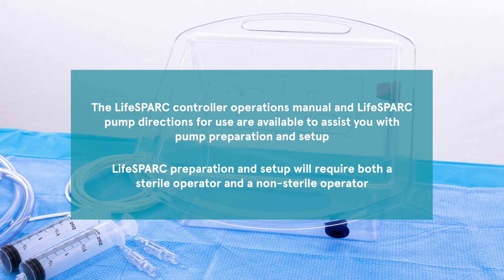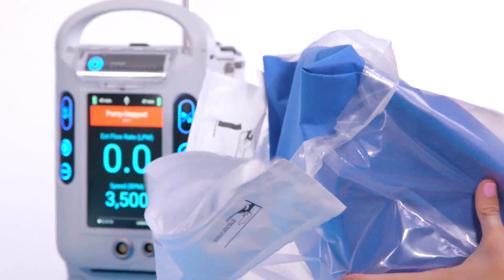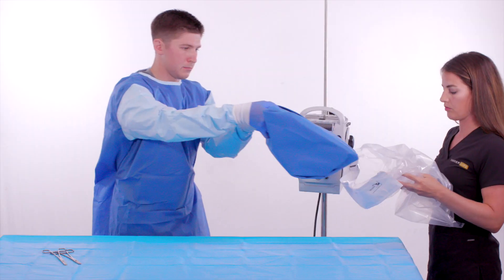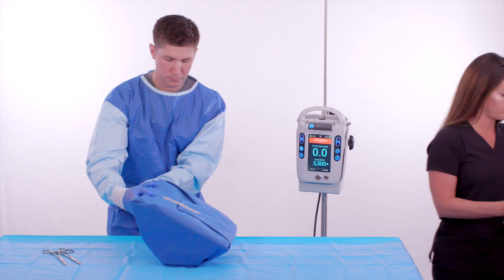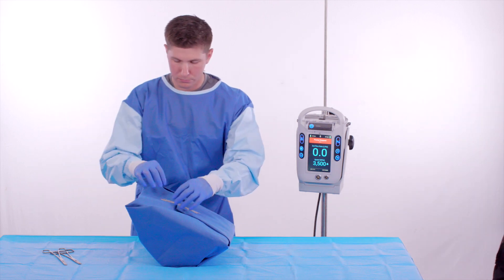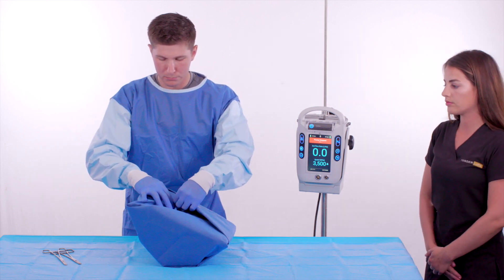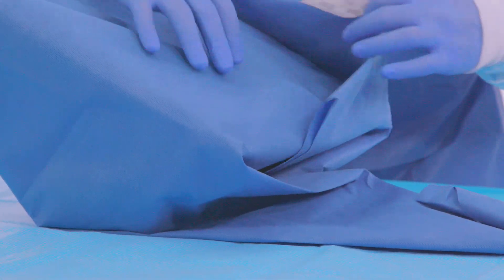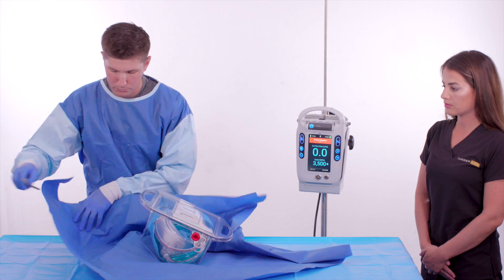Preparation and setup will require both a sterile operator and a non-sterile operator. The non-sterile operator opens the priming tray package and presents it to the sterile operator. The sterile operator removes the priming tray, places it in the sterile field, then unfolds the sterile drape by removing the tape and spreading out the drape.